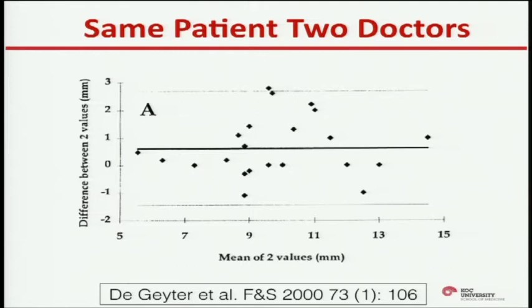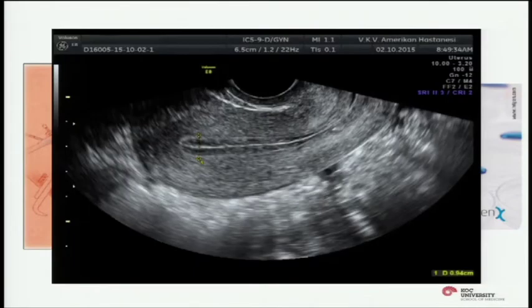On the other hand, you can regard it as a crude measure, with a controversial association with functions at the molecular level. But anyway, even if we accept it as a readily available, practical, easy-to-use tool for assessing endometrial function and receptivity, let's see how good we are at measuring it. Look at the image. It seems pretty straightforward.